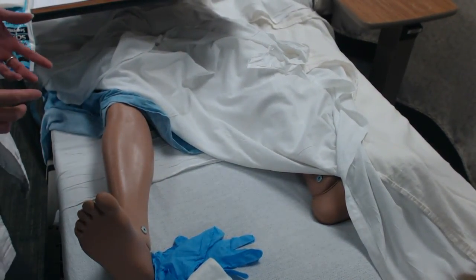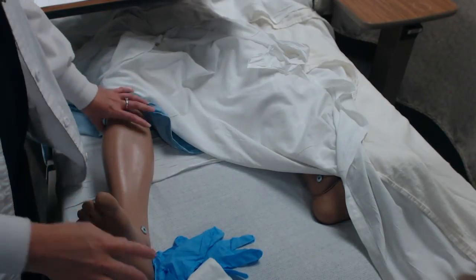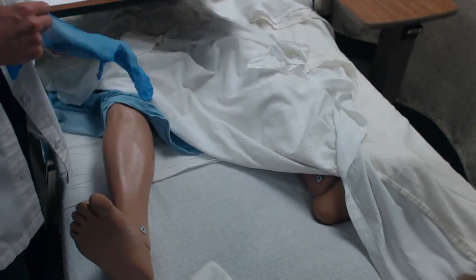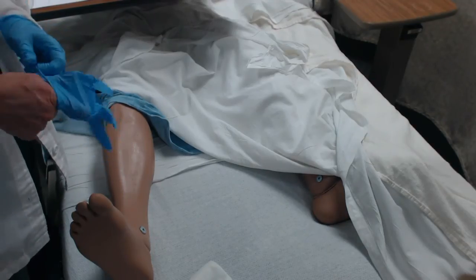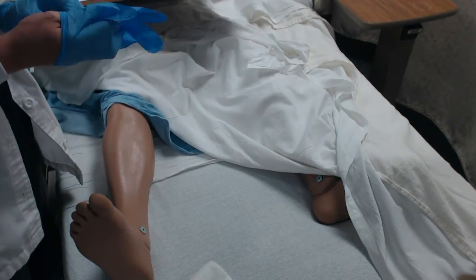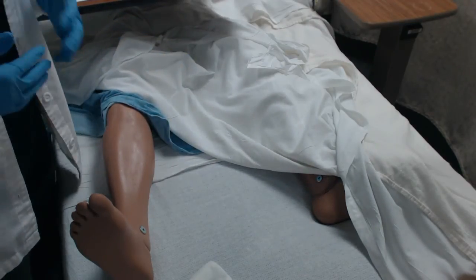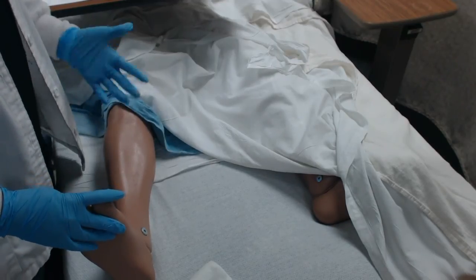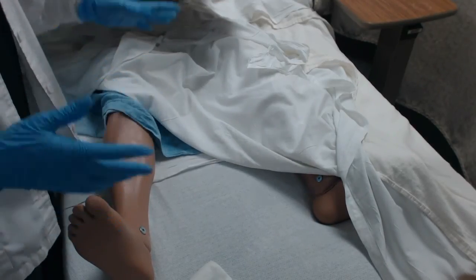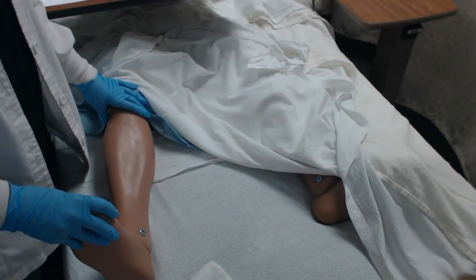And what I always recommend first is putting on gloves, because you don't know whether or not the patient has cellulitis or an infection of the leg, if they have any weeping or fluid coming out of the leg, which is called edema, because these are some of the reasons why we would apply a TED stocking to begin with, to help promote circulation. So I always recommend putting on gloves prior to applying TED stockings.